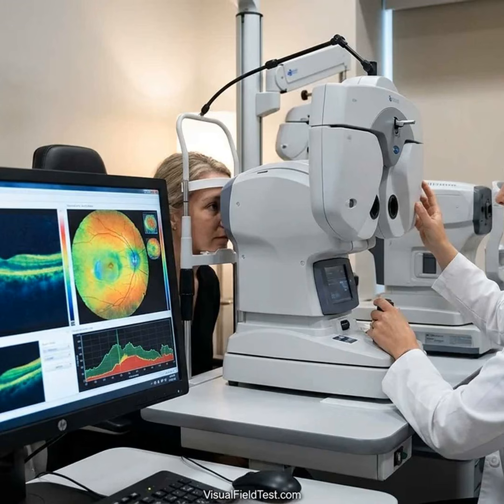However, more sensitive does not mean perfect. A few points to remember. OCT measures anatomy, structure, while visual fields test function, what you can see. Early on, many eyes actually lose nerve fibers before vision loss happens. But not every eye that looks thinner on OCT will go on to get field loss soon. Doctors still watch and use all evidence.